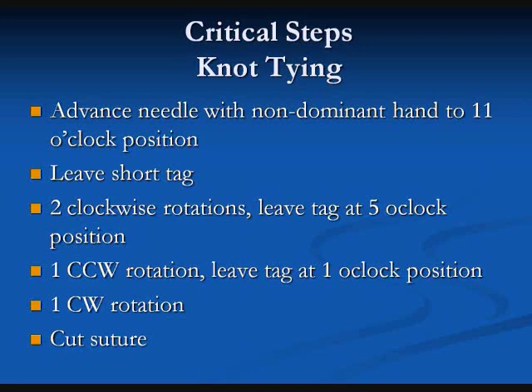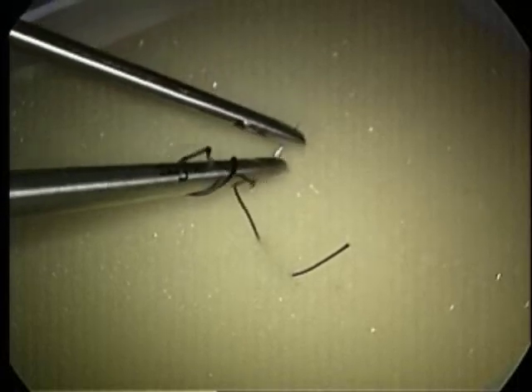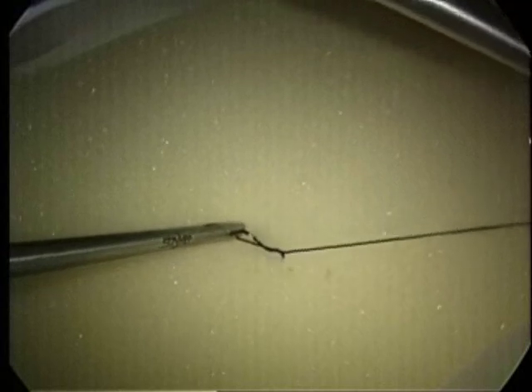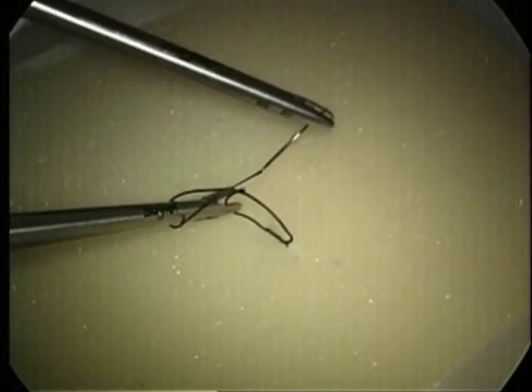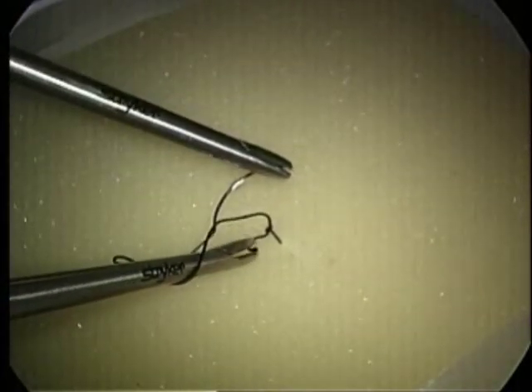The first wrap is two clockwise turns with the needle positioned to the left of the knot and the tag of the suture positioned on the right. This allows the dominant or right hand instrument to fall on top of the tag after the clockwise rotation. At this point, the left hand — or the non-dominant hand — goes to the one o'clock position and the right hand leaves the tag at the seven o'clock position.